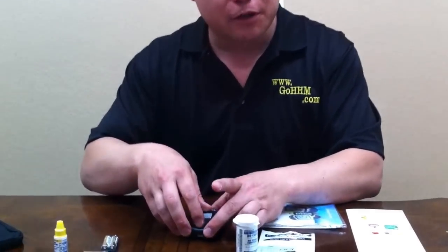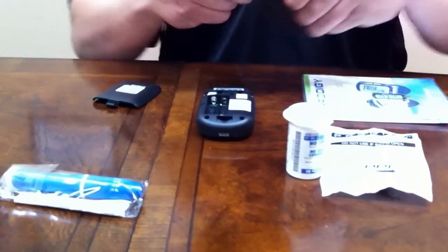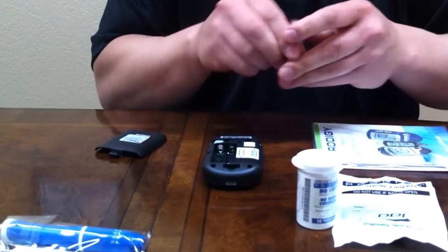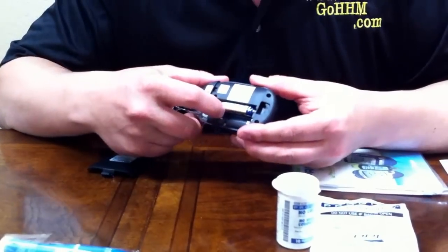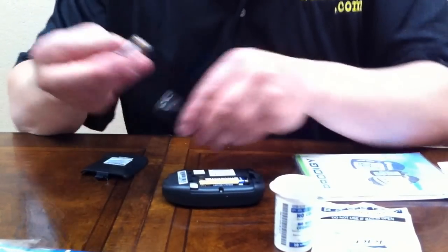The first thing that you do upon receiving your meter: open the back, open your batteries, and place the batteries in as directed. For the visually impaired, remember, the bottom with the spring is always the side that the flat end of the battery goes in.